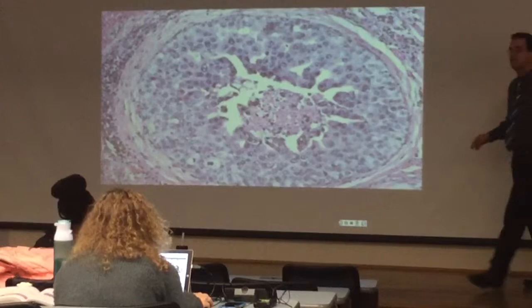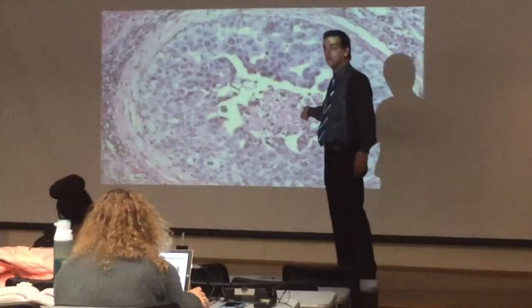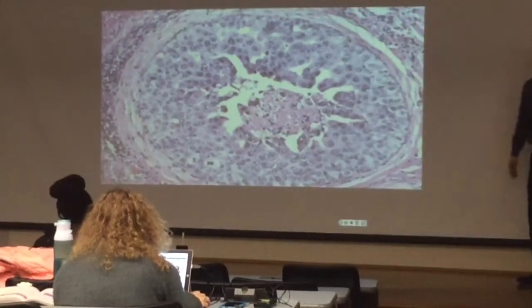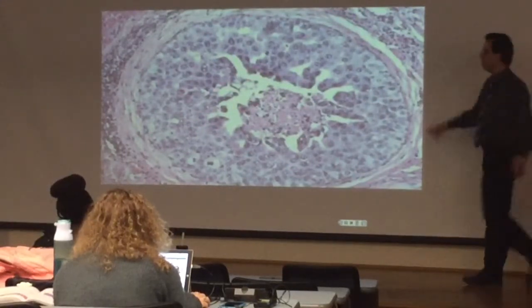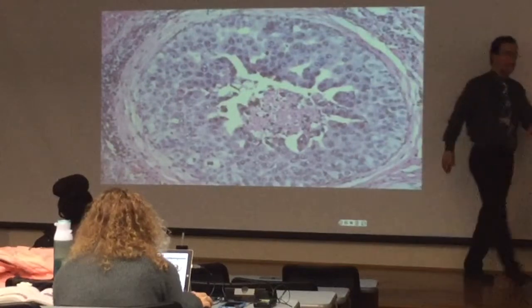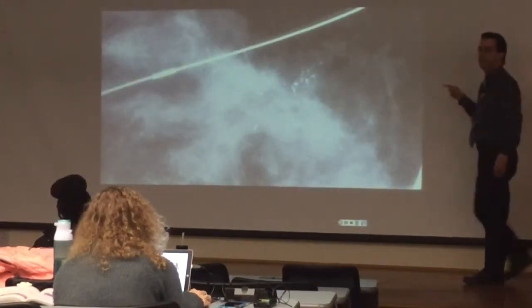By the way, invasive cancer arising from low-grade DCIS is usually low-grade invasive cancer. Invasive cancer arising from high-grade DCIS is a high-grade invasive cancer. So that's also important. By the way, this DCIS comedonecrosis is important because this is what they can pick up in a mammogram. This kind of branching is dystrophic calcification. This is what you need to know about breast cancer.